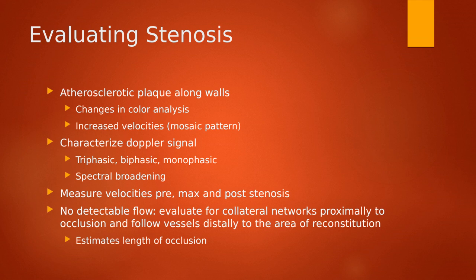I'm not getting any waveform when I Doppler it. That's going to be indicative that there's going to be some kind of occlusion in that area. Now, when we have an occlusion, we don't want to just call it a day. We want to still evaluate it. We still want to prove that it's occluded.